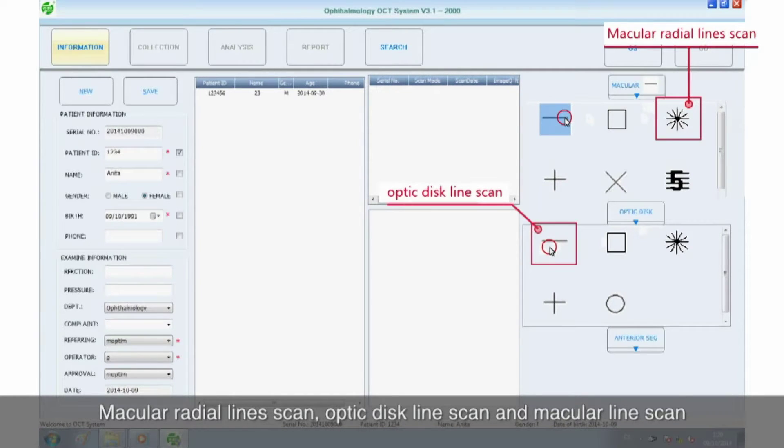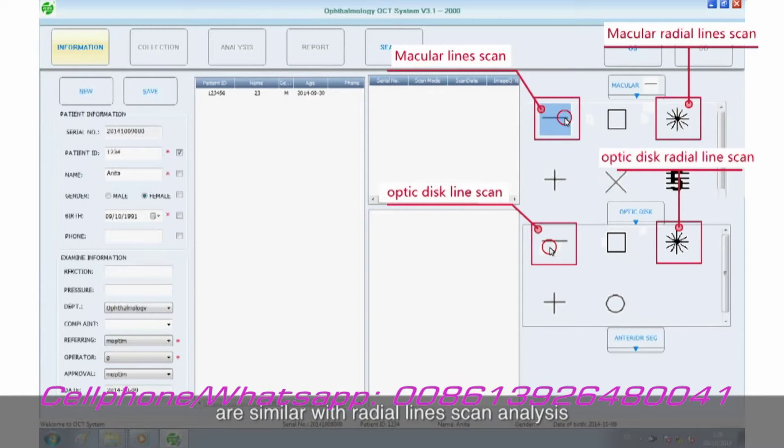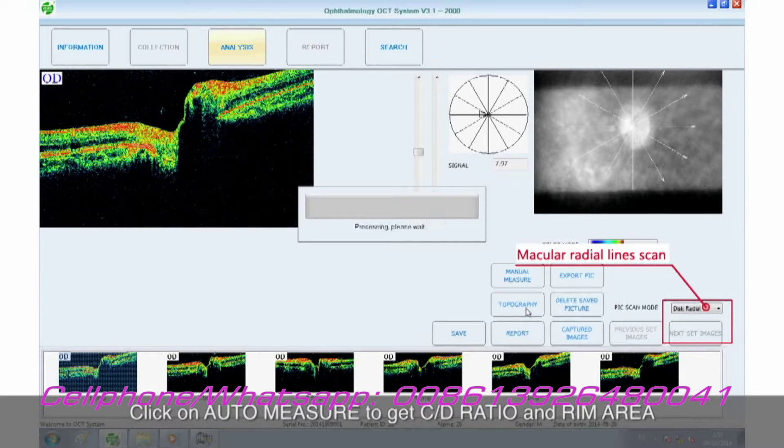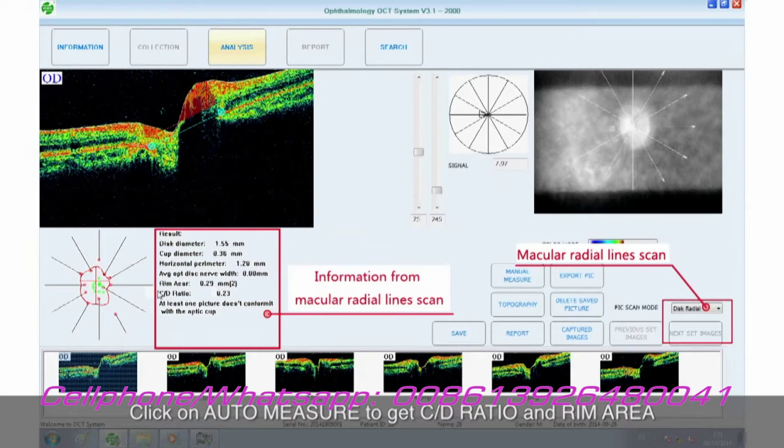Optic disc line scan and macular line scan are similar with radial line scan analysis. Click on Auto measure to get C slash D ratio and rim area.